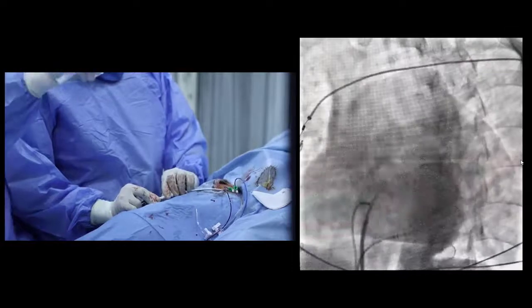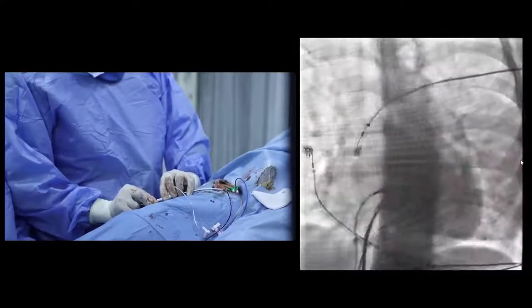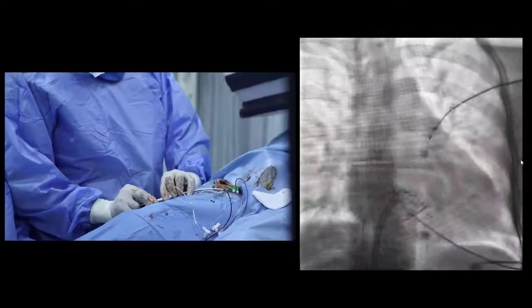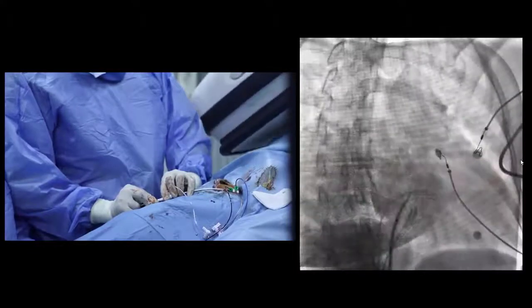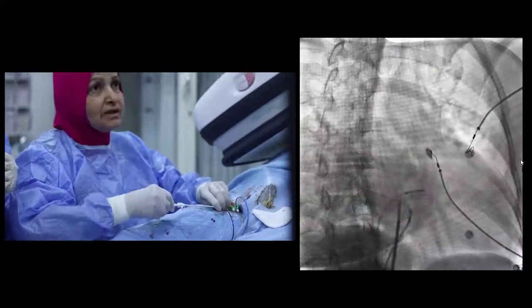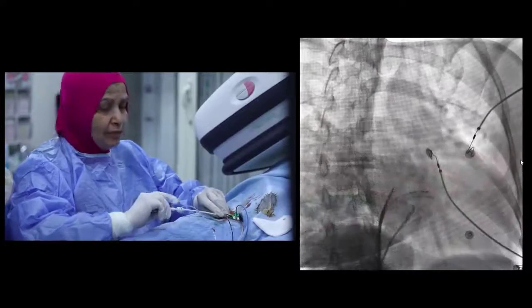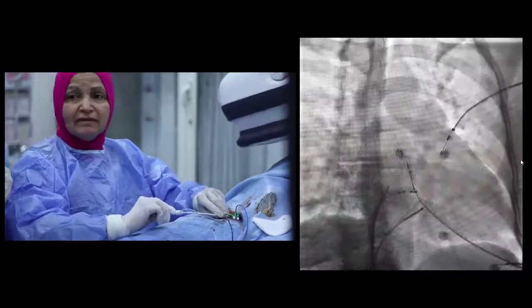Here the LAO view. Then we get back into the RAO view to see how posterior or anterior we are. This is a much better posterior position of the transseptal needle.